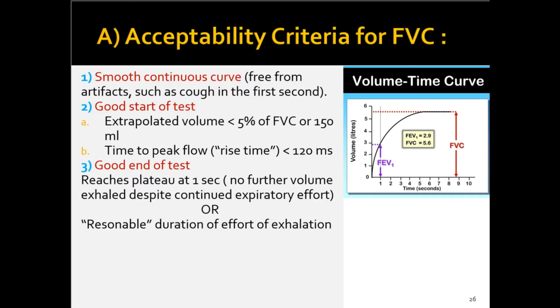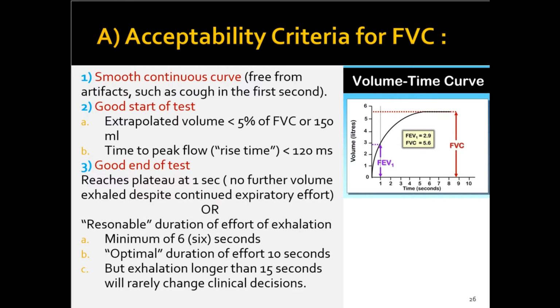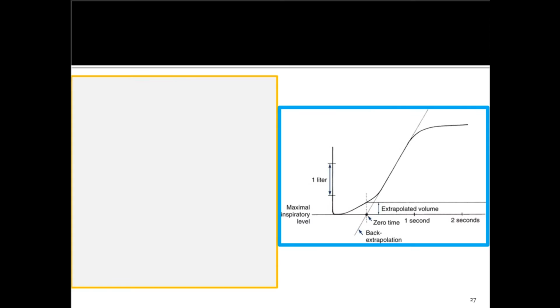Reaches plateau at 1 second, with no further volume exhaled despite continued expiratory effort, or reasonable duration of effort of exhalation. Minimum of 6 seconds. Optimal duration of effort is 10 seconds. But exhalation longer than 15 seconds will rarely change clinical decisions.